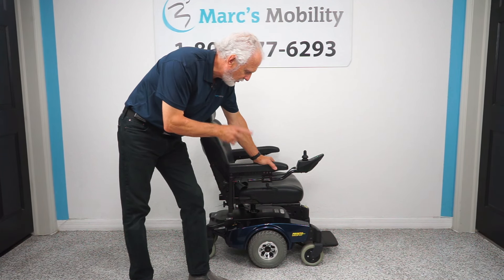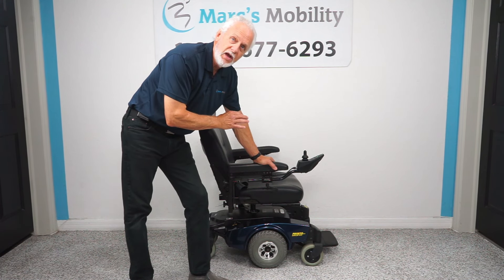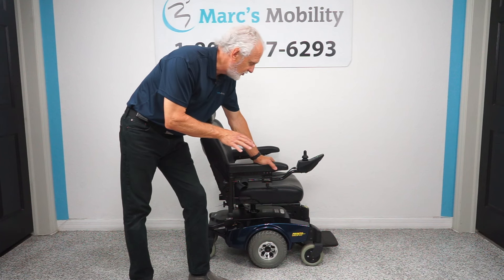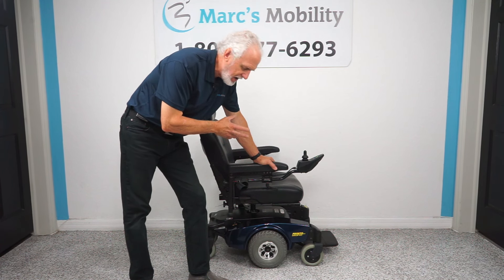You can't find these anymore, but we found this one because it was sitting in someone's home. It's literally brand new and has almost no miles on it. I think it was used just a couple months. So this is a Pronto M51 — what makes this chair so well in demand?